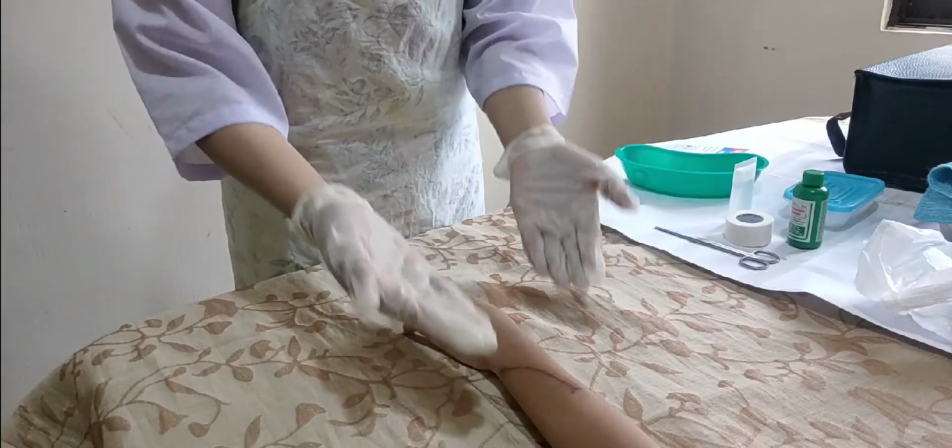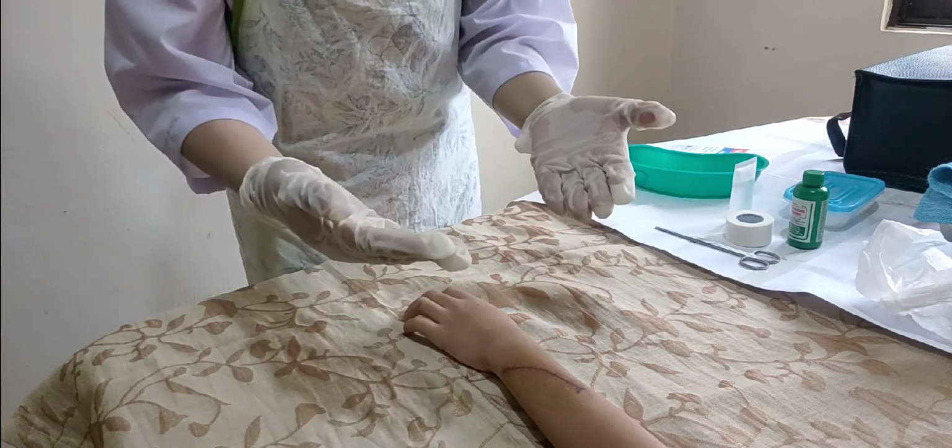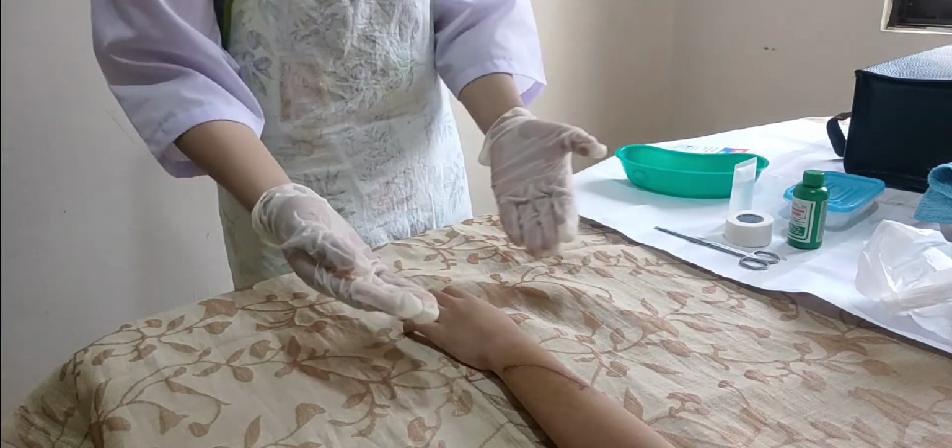The surgical incise wound is not infected, therefore, we will directly dab the inner wound then into the outer area of the wound.